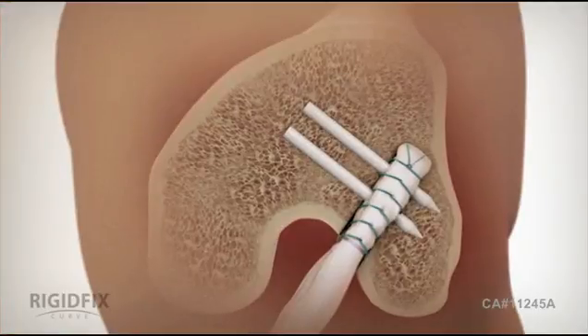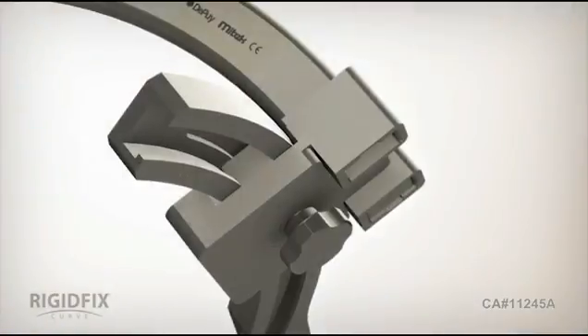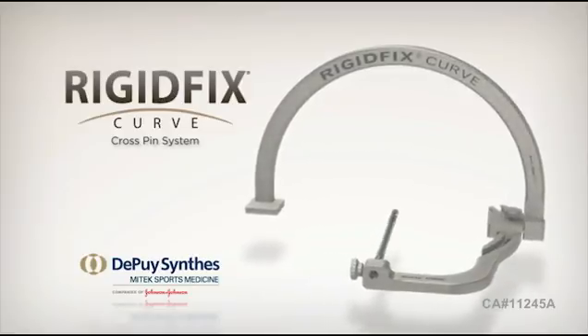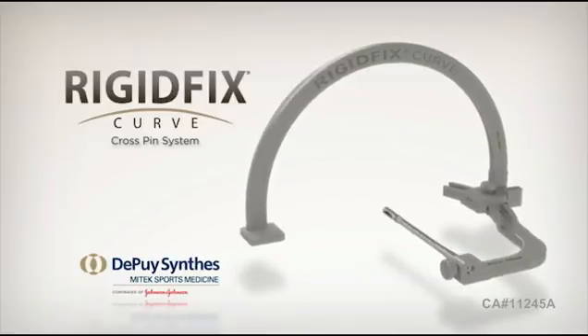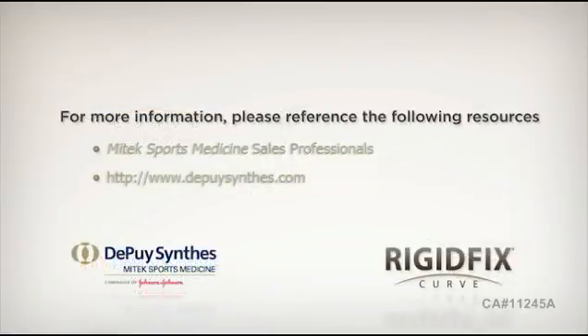Carefully remove the sleeves with the removal tool. Then complete tibial fixation according to standard practices. Using the rigid fix curve system and following these steps will help maximize lateral bone stock and decrease the risk of cross pin protrusion. The rigid fix curve cross pin system offers surgeons a safe, effective, and reproducible solution for an anatomic soft tissue ACL reconstruction through the anteromedial technique. This unique cross pin technology also offers 360 degrees of graft to bone contact plus added compression to improve healing and close to aperture fixation, all providing a strong, rigid reconstruction.